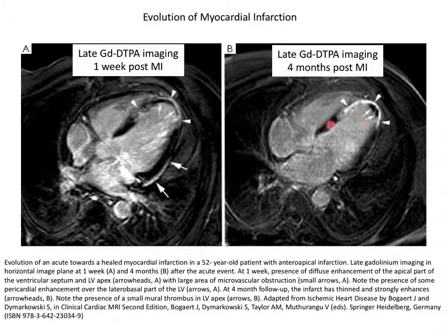So you can, through the appearance of the myocardium, determine how old that insult is, right? So we've done patients who are completely asymptomatic, you know, they're in for some other reason, and then you look at their heart and you go, hey, there's something going on in their heart, and the gadolinium is lighting up certain regions, and it's obvious they had a heart attack at some time, but they just shook it off.